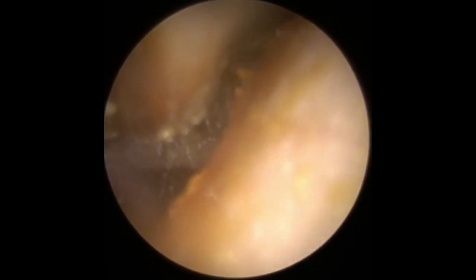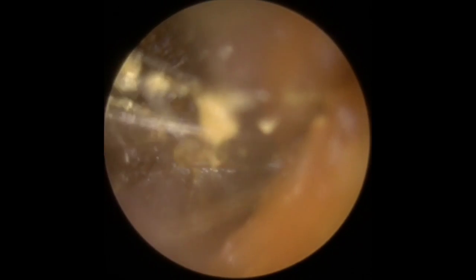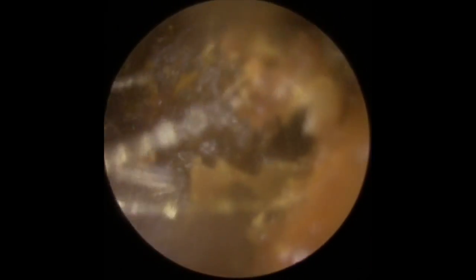Just working our way into the canal, sucking up lots of these little bits and much softer bits of wax. There is more than likely, in the middle of this, a much harder piece or a drier piece that we're going to come across. But at the moment, it's just a case of hoovering up all the softer debris bits first of all.